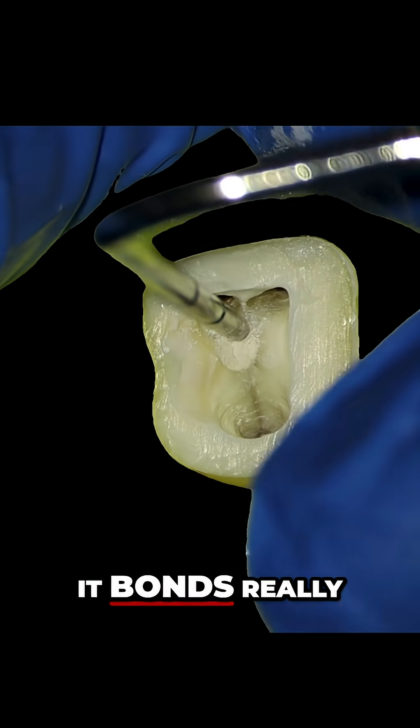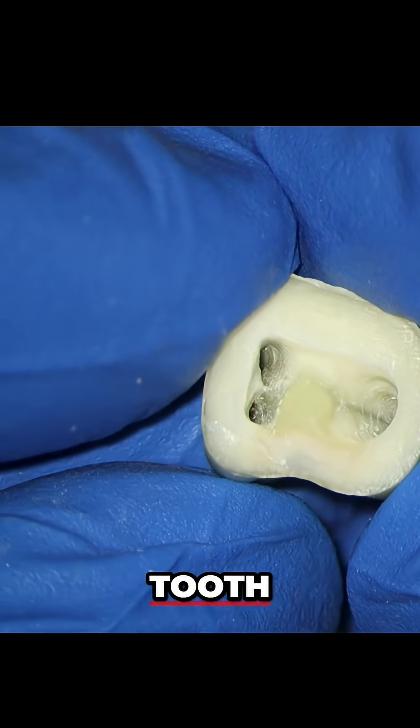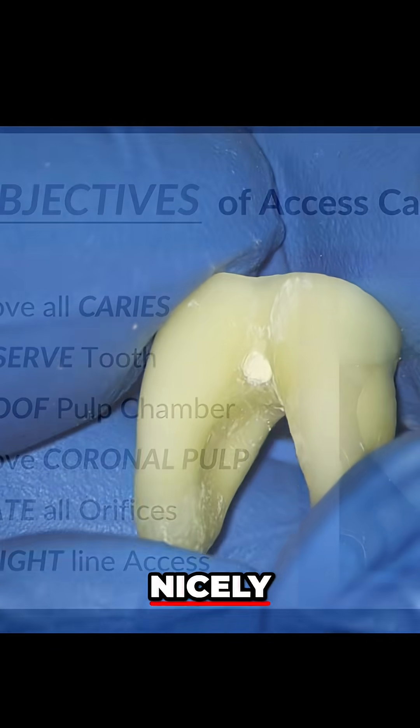or once it sets, it bonds really well to composite. When we look at the underside of this tooth, we can see that it's filled the hole really nicely.